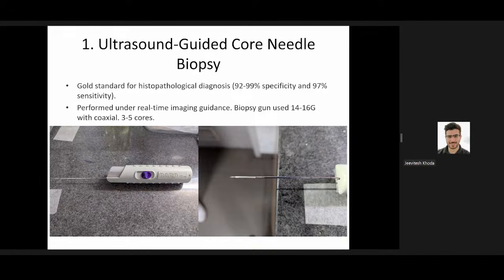But some breast lesions, especially when the lesions might turn out to be fibroadenoma, can be very hard, and piercing them manually can be difficult. So at least in my practice, I have found that automatic can be very helpful and doesn't have any difficulty in piercing these hard lesions as well.